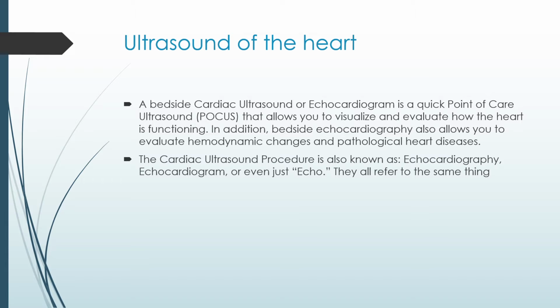These two are actually not the same thing. So the transthoracic echocardiography, the TTE, this is when the cardiac ultrasound is performed on the patient's chest. TTE is the most common cardiac ultrasound application and this is non-invasive. The TTE is what we will be covering in the post.